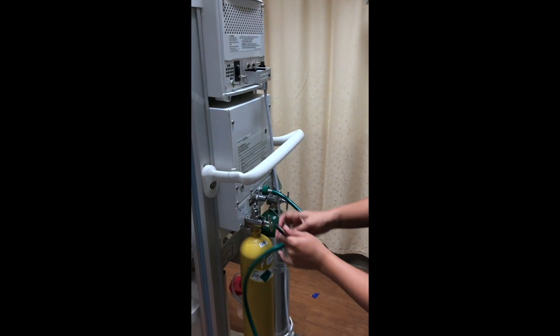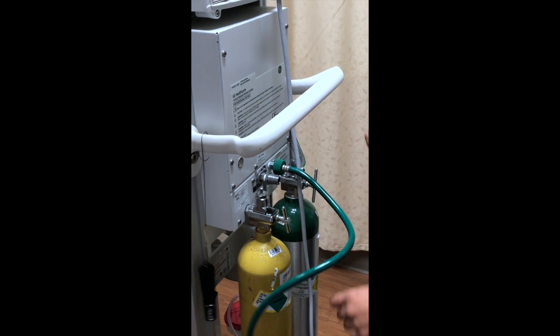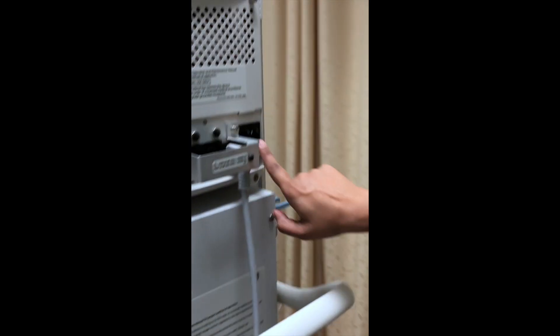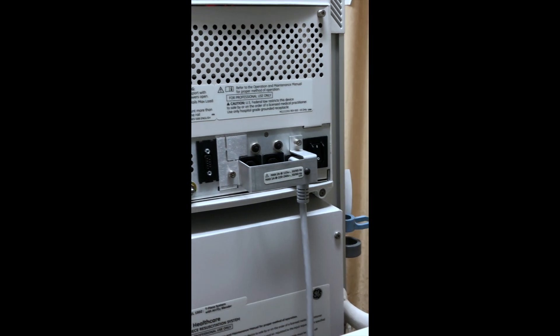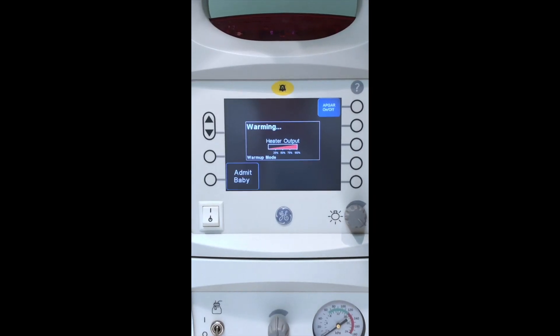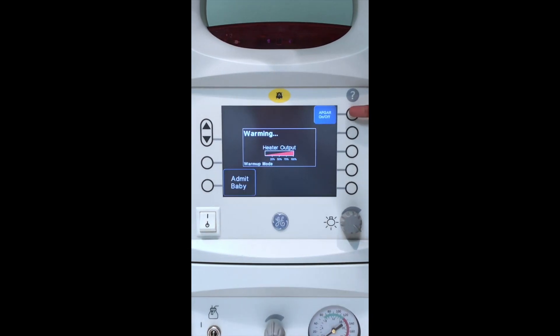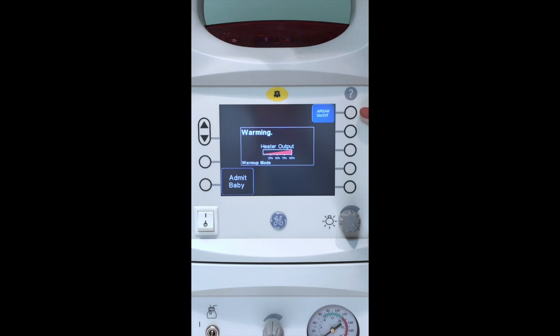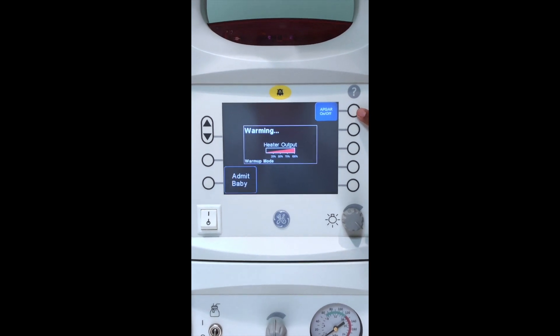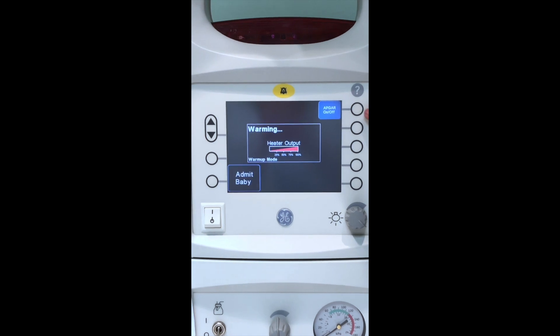Then you will turn on your air — righty-tighty, lefty-loosey over here — and you want to make sure your on button is on. Going over to the other side, it is now warming up for seven minutes. It'll be on 100%. But if you don't admit the baby or acknowledge that the baby is here by turning on the APGAR, it will go to 50% heating power after seven minutes.